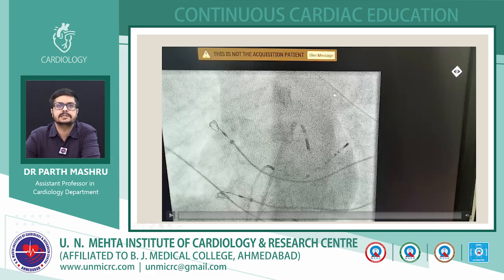And this is during the electrophysiological study and radiofrequency ablation. This is the fluoro image showing the heart in the LAO position, where you can see that the mitral annulus is somewhere over here. It is located like this. The tricuspid annulus is located like this, and this is the coronary sinus, where the coronary sinus decapolar catheter is placed. We have performed the septal puncture from the right atrium to the left atrium and reached the mitral annular region at about 2 o'clock origin.